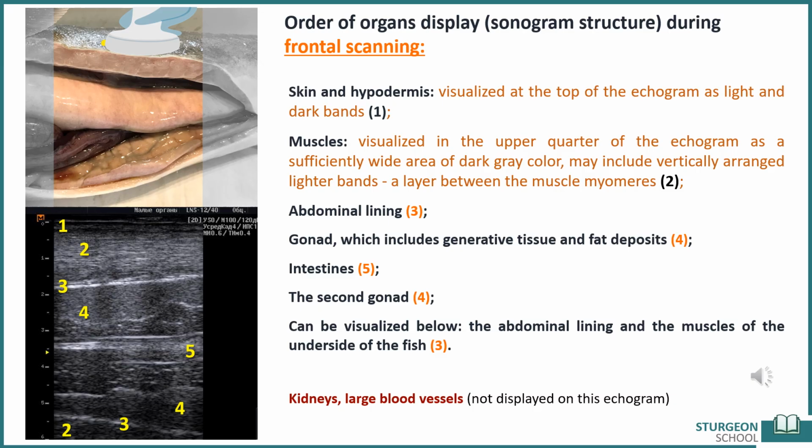Now directly about what we see on the sonograms, based on the assumption that the transducer is set correctly and that the scanner screen shows exactly what we want to see. We will also consider variants with incorrect placement, but later. So, the classic sonogram of a longitudinal scan of the reproductive system of sturgeon.